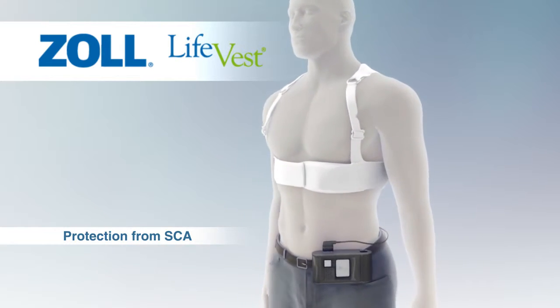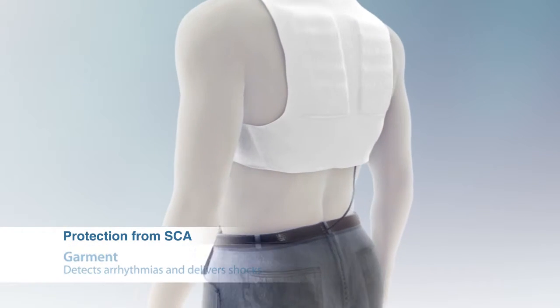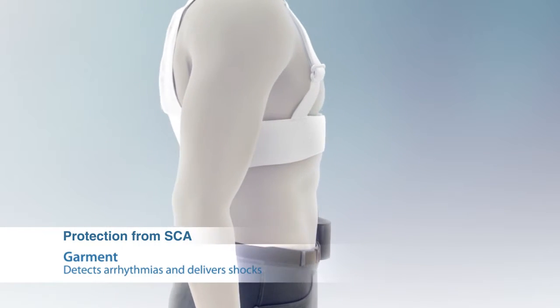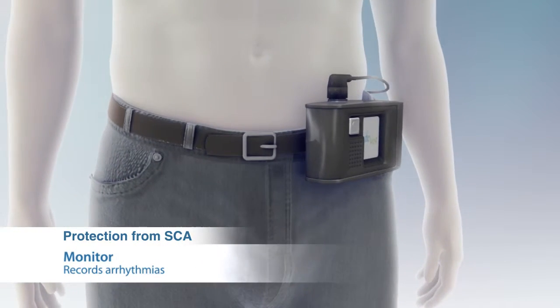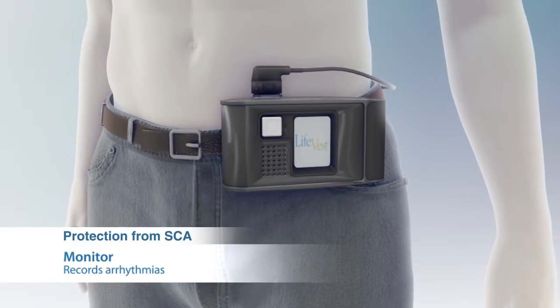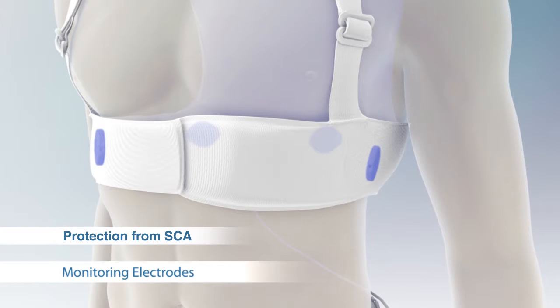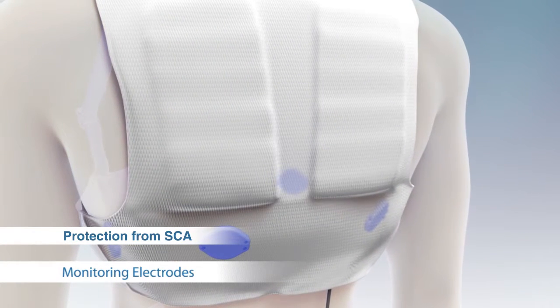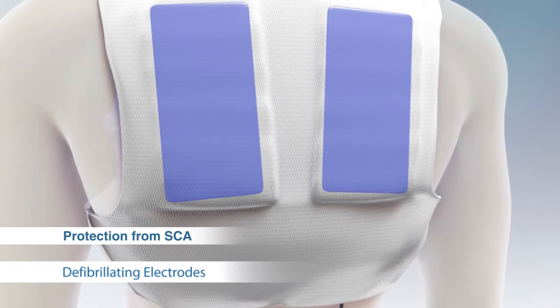The LifeVest consists of two main components: a garment and a monitor. The garment is worn under clothing and detects arrhythmias, delivering treatment shocks to the heart when necessary. The monitor is worn around the waist or from a shoulder strap; it monitors the heart, records arrhythmias, and determines when treatment is required. Electrodes are contained in the belt around the body. ECG electrodes continuously monitor the heart rhythm, and therapy pads deliver treatment shocks to the heart when necessary.